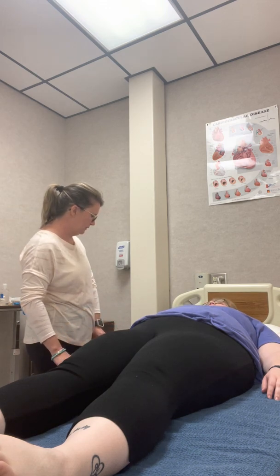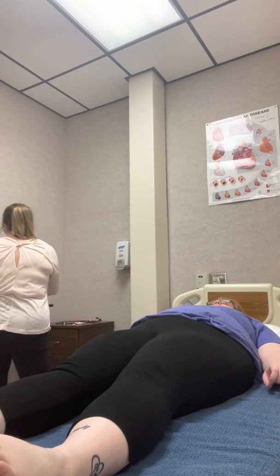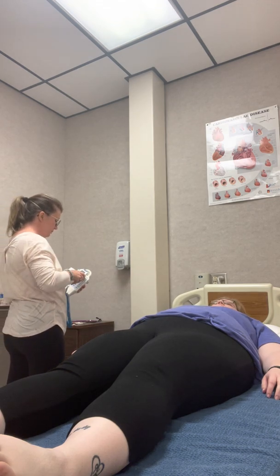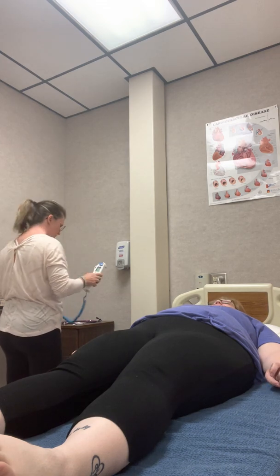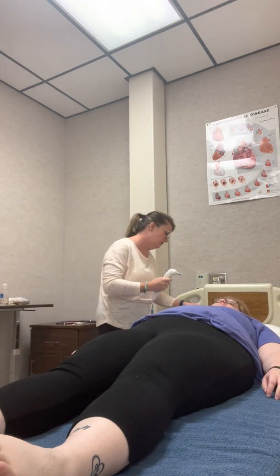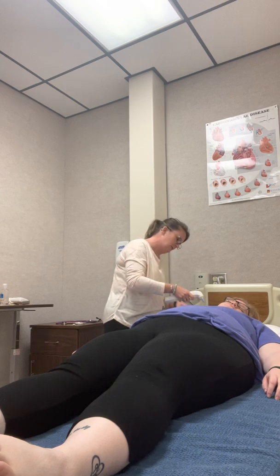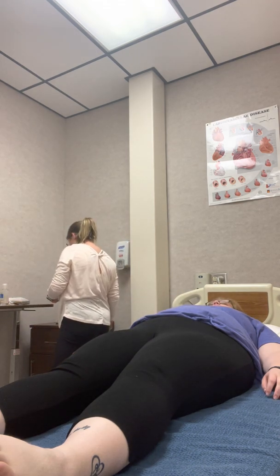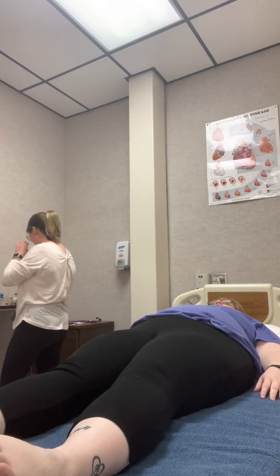Okay. So while we do that, I'm just going to take a couple of the vital signs here. Sounds good. First thing I'm going to do here is check your temperature. Alright, so this is just going to go into your ear. You can turn your head for me. Oh, my temperature is 99.0. Oh, really? You're good on there? It's been hot all day.